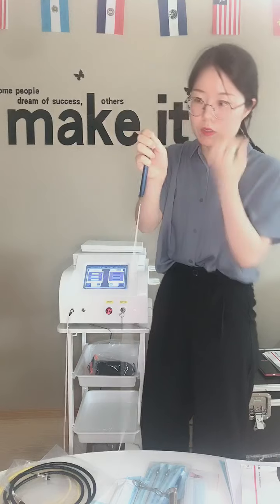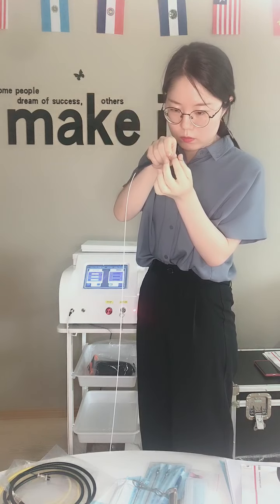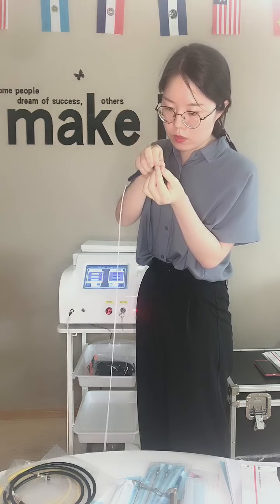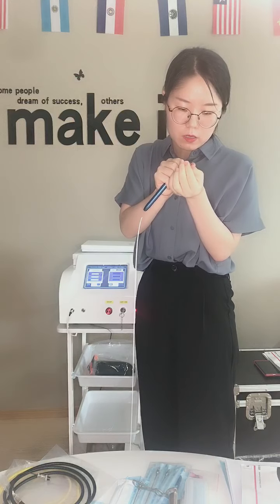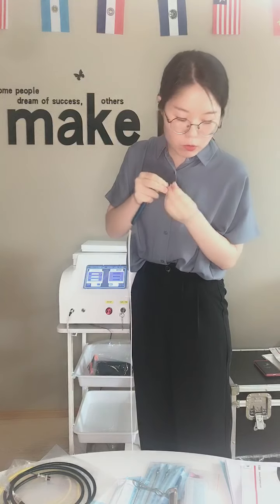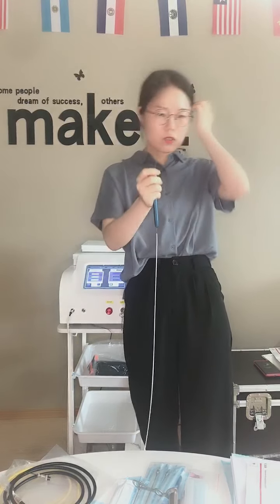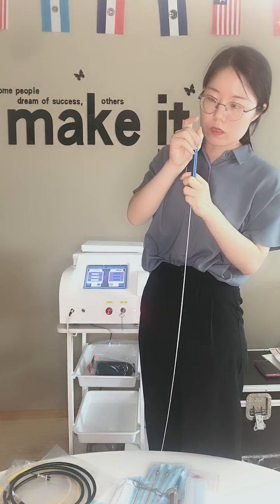So it just burns, so the bigger size here. It's not easy to put now. The right way is we should cut this part and put it on the other way. The right way is to cut into this part because just now we just burned it. So on the top here, it is very big.